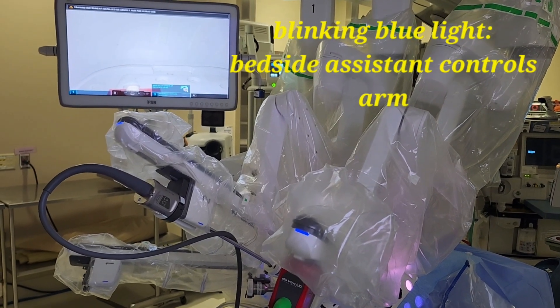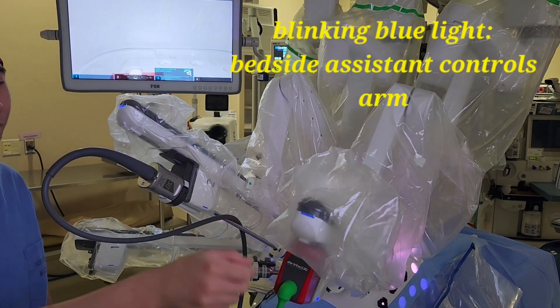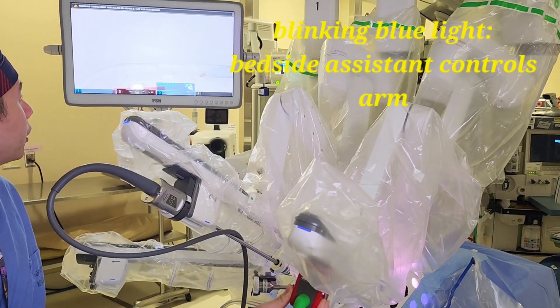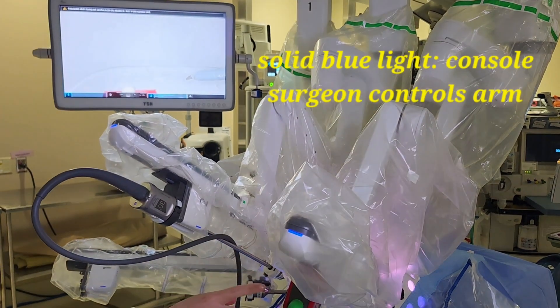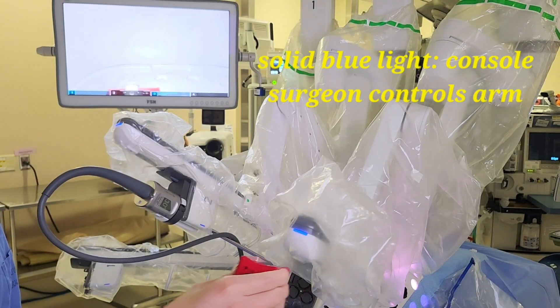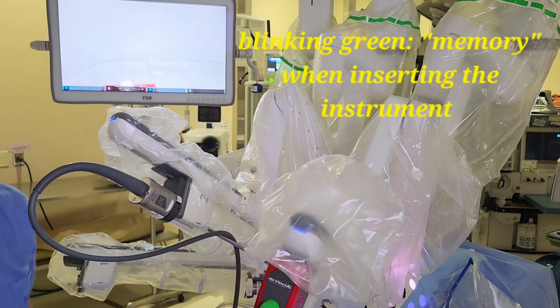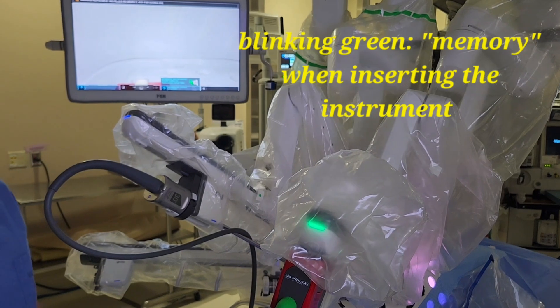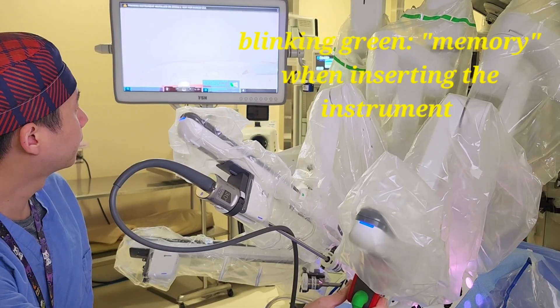There are several different color indicator lights on the robot arms. The most common is the blinking blue, which means the assistant has control of the arm — you can push it in until you see it. A solid blue light means the console surgeon has control of the entire arm. A green light occurs when you take out the instrument; this means it has a memory of the last instrument position, and all you have to do is push it back to that last position.